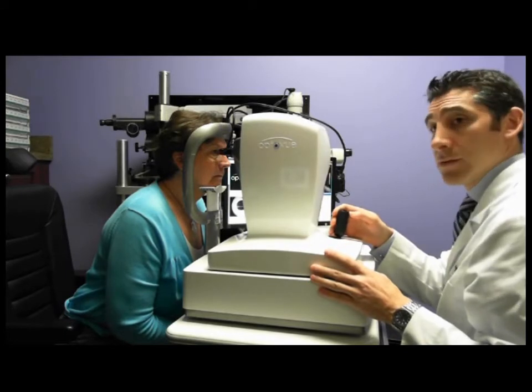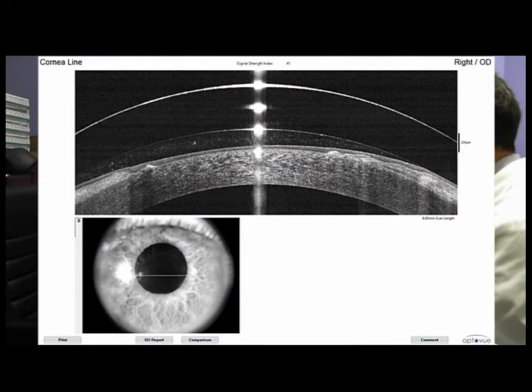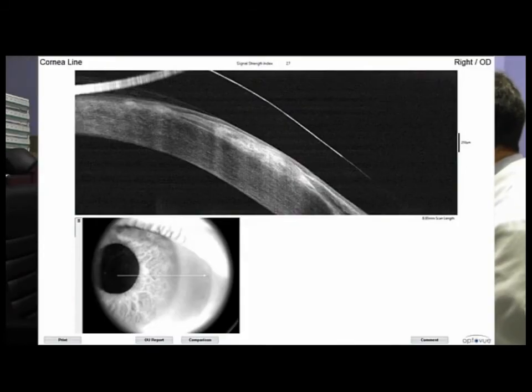Okay. And so what we talked about with the slit lamp inspection is exactly the case. With OCT, we can see we're bearing on a nodule nasally. To highlight this a little bit better, if you can see my pointer, as the posterior surface of the lens comes and lands on the cornea, this is landing on a nodule, and so there's no space in between here. That's problematic, which is producing the sensation that she's noticing.